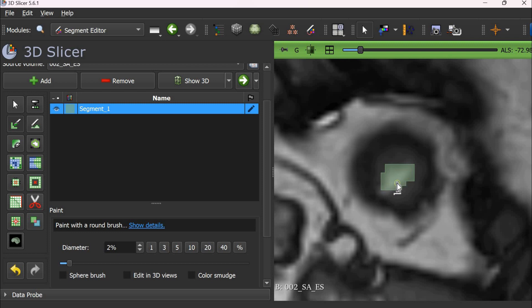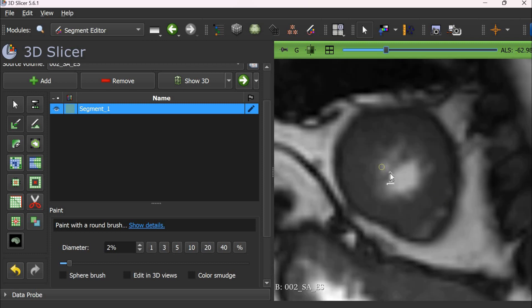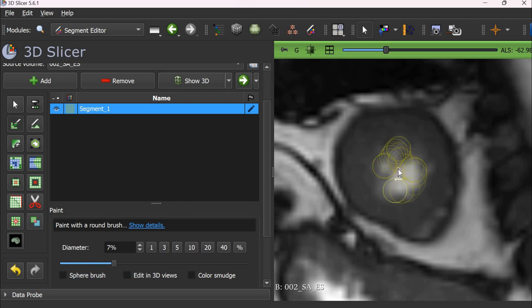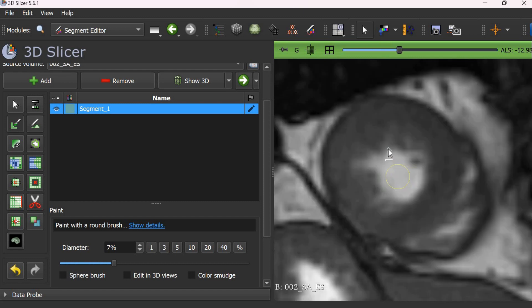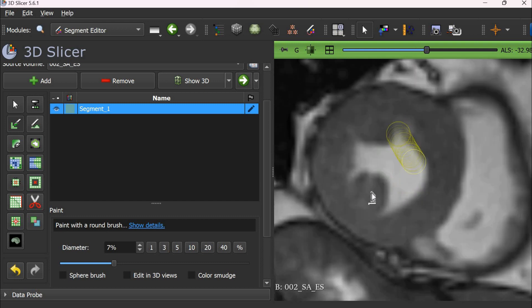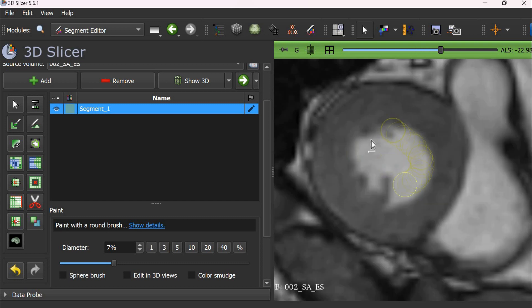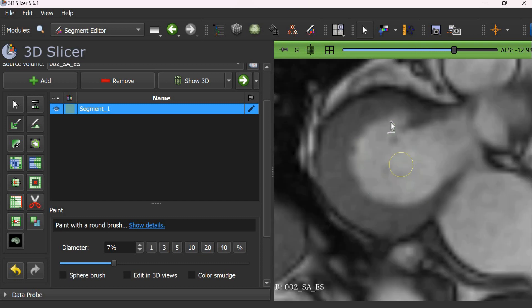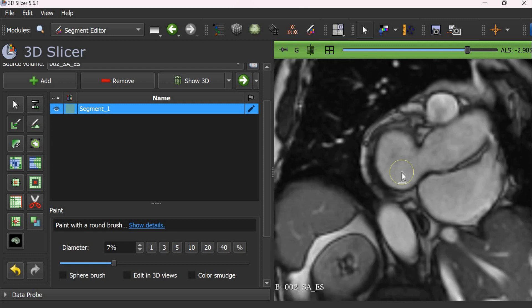Then we move to the next slice, draw the ROI again. So one by one, we draw the mask where we think it is present. Please note that this is the first round of mask creation and it will not be perfect. So now we save this as a file before we send it for revisions.